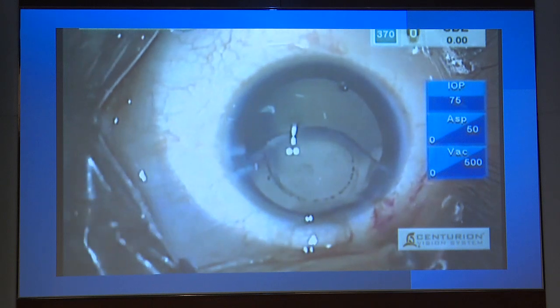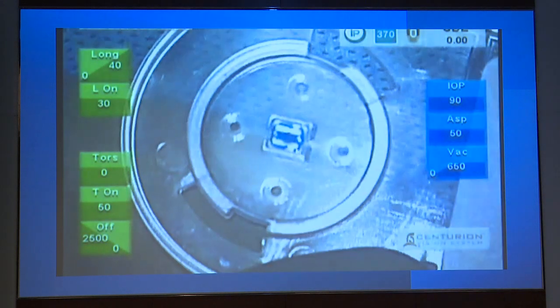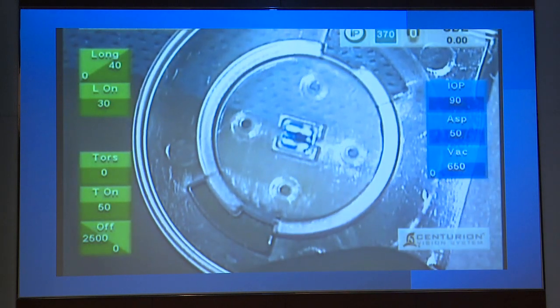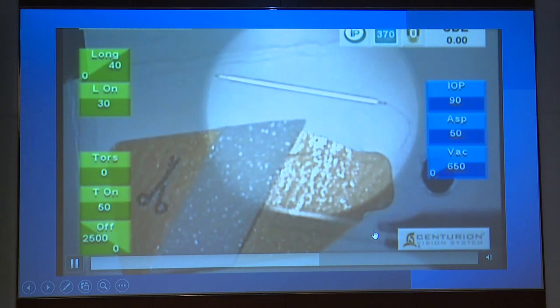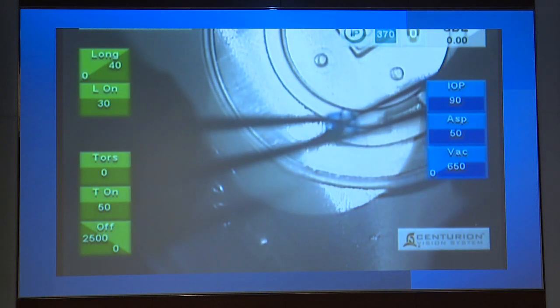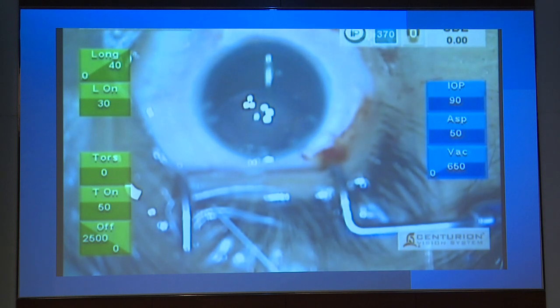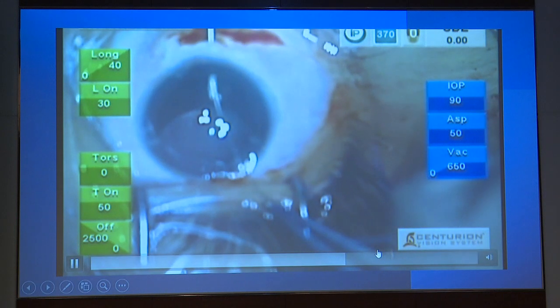Let's mark 3 mm from the limbus. Now let's look at the ASIA anchor, a device fashioned after a boat hook with 2 limbs. We retrieve a double-armed Prolene from supplies and thread one end of the needle through the suturing hole of the ASIA anchor and then tie it tight. Railroad the suture out of the eye and position the anchor to support the capsular bag.